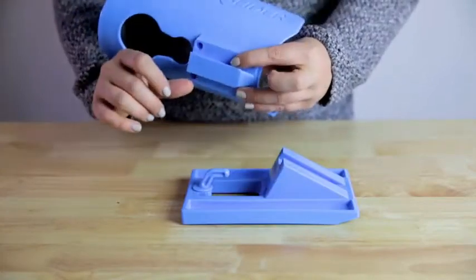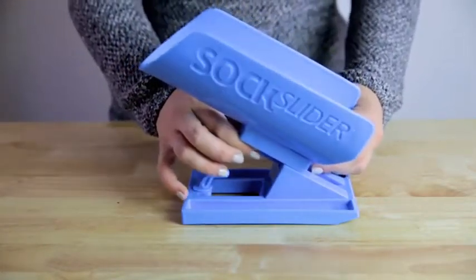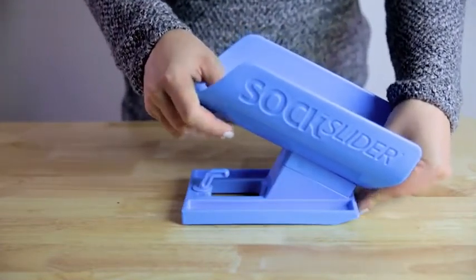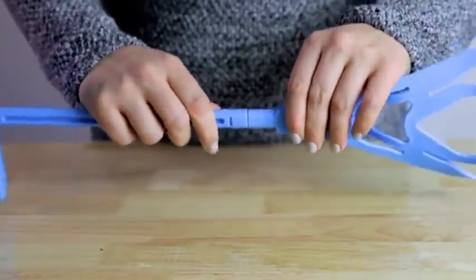To assemble, align the sock cradle with the notch in the Sock Slider system's base and gently push down until the sock cradle is in position. Next, firmly push together the two pieces of the handle until it is secure.